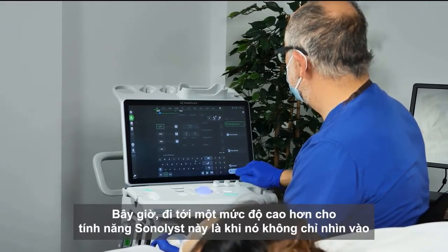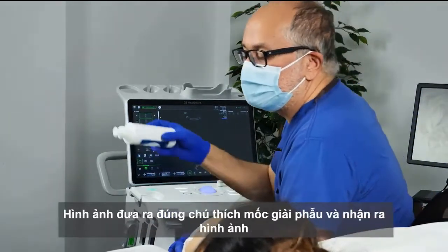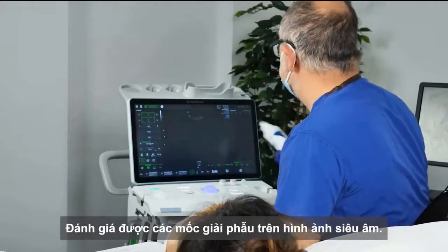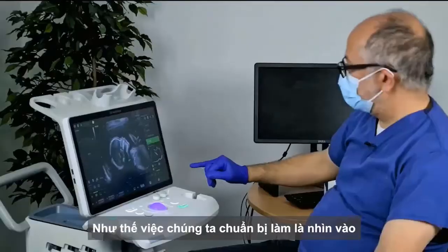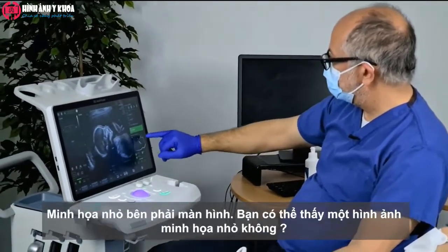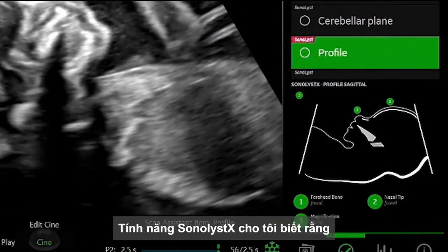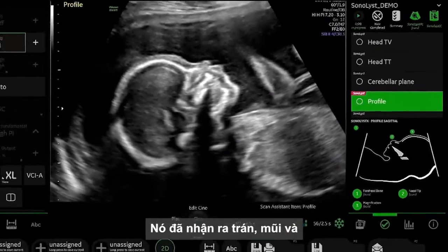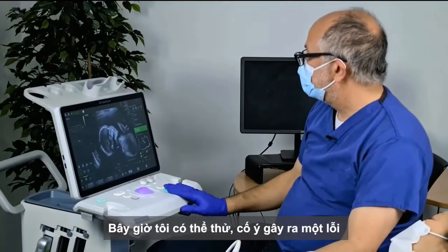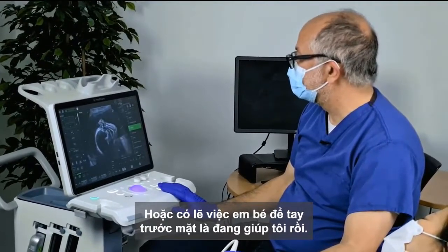Now, the next level for this system is where it's not just looking at the image and recognizing the image, but also assessing the quality of the image. Okay? So what we're going to do is look at that now. What it's doing, it's recognizing the profile, but it's also giving us these little cartoon. Can you see a little cartoon? It's the other way around from the baby. But it's showing me these three little green dots. It's telling me that it's seen the forehead, it's seen the nose, and that the magnification is adequate for the picture. Now I can try and on purpose make a mistake, or maybe the baby puts the hand in front of the face, which is kind of helpful.